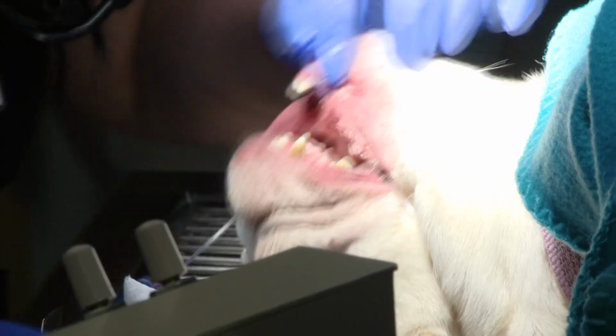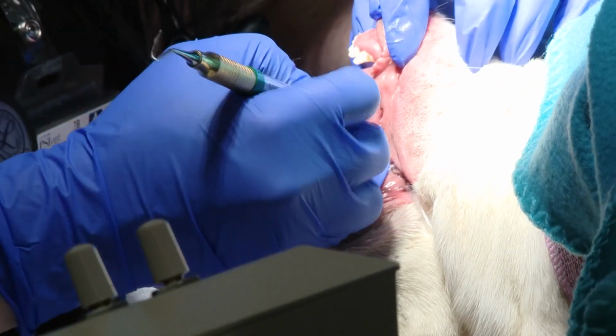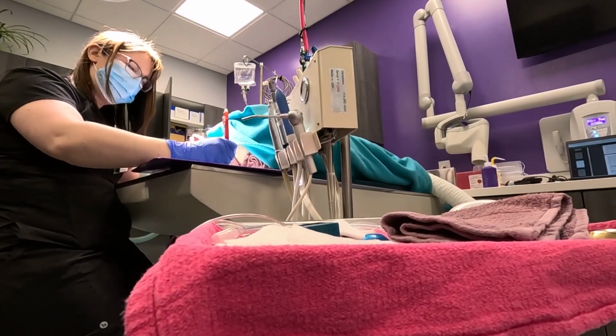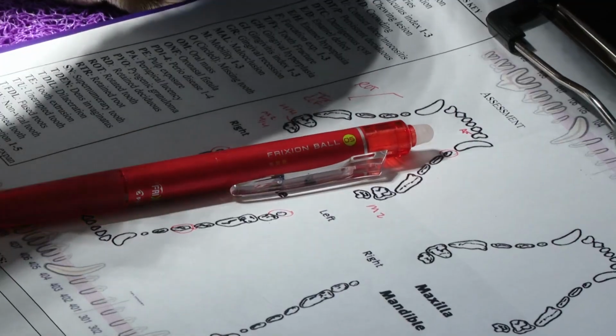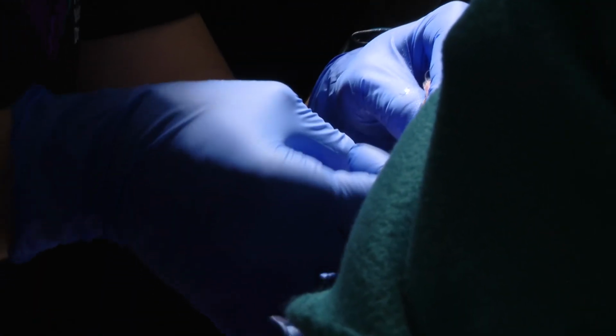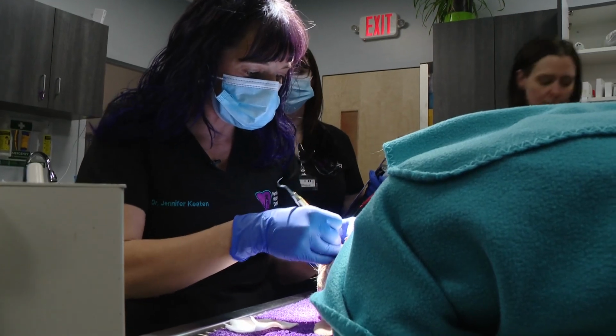The technicians also start probing the teeth, just like at your dentist. They look for pockets, 2, 2, 2, 3, 3, 3. We do the same thing. So while I'm reading the images, they're going to do an oral exam, and we combine those two pieces of information to make a treatment plan. And then I do nerve blocks, so their mouth can start to get numb in the areas that need to be numb, and then they're going to clean the teeth, and then I'm going to do oral surgery. Yeah, that unfortunately does have a fractured tooth, so she will need one extraction today.